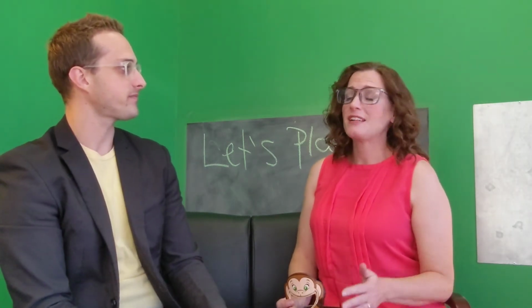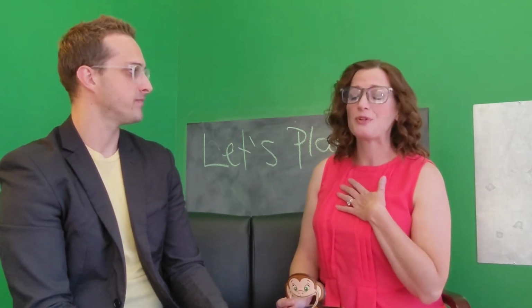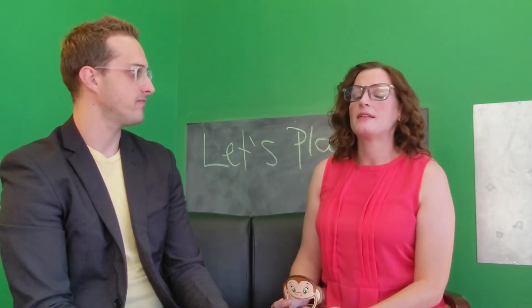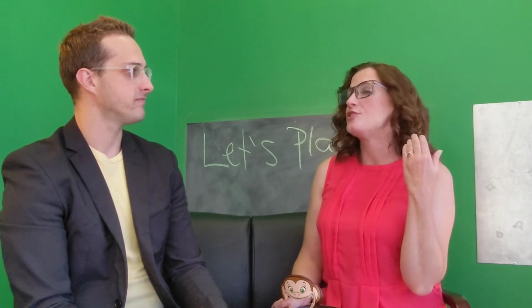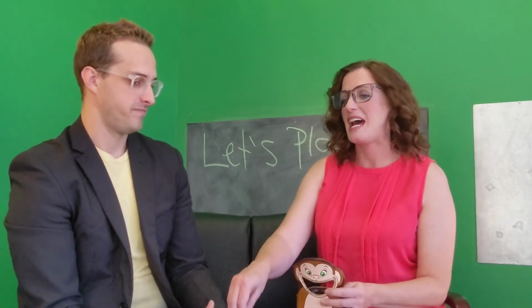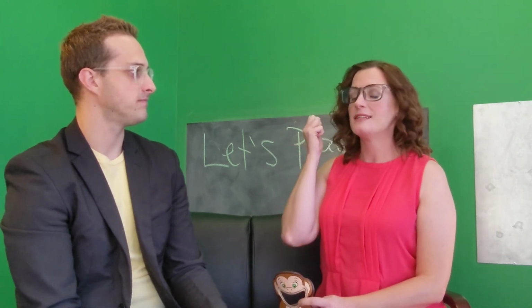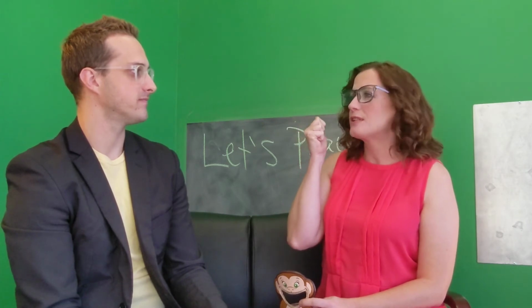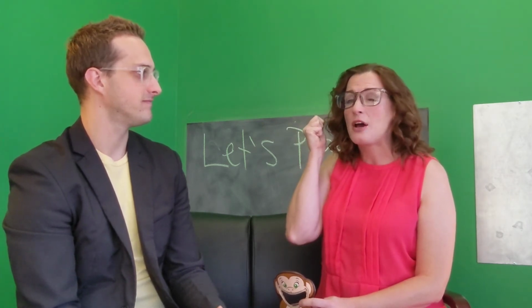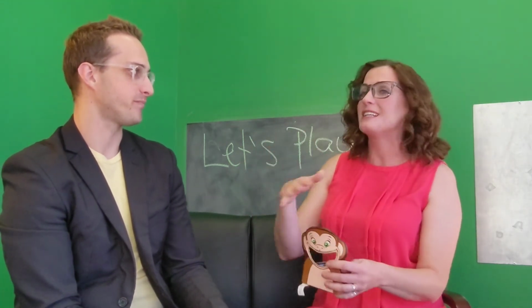Another trick I learned from Dr. Kayla Sivas, who's another fantastic pediatric audiologist. She used this a lot, and I found it super effective. Sometimes I will say to a kid, okay, let's close your eyes, because if you're closing your eyes, you can hear a little bit better. And I kind of just stretched the truth a little bit there. But what's so fun about that technique is maybe they have a toy, but what I'm really looking for is for them to show that they heard a sound. So they'll hold the toy and I'll say, okay, close your eyes really, really tight, and they will. And the second I present the sound, they go like this. So that's a response to sound. I'll say, you heard that? Good job. Now you can feed it, and it's kind of training.